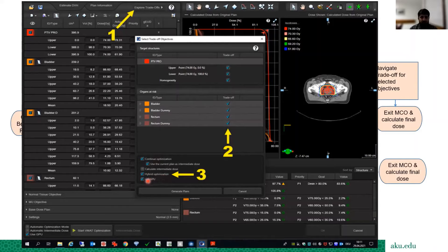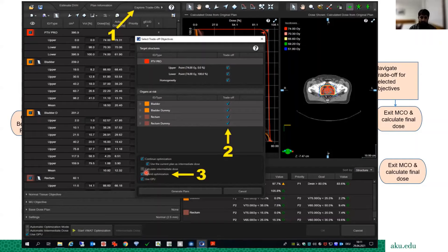In older systems, GPU and hybrid were separate options, but in latest versions hybrid optimization covers GPU automatically. Without GPU, MCO may take two to three hours depending on the number of objectives selected. With GPU, it will typically complete in about half an hour. If there are only one or two objectives, it may take as little as five to ten minutes.